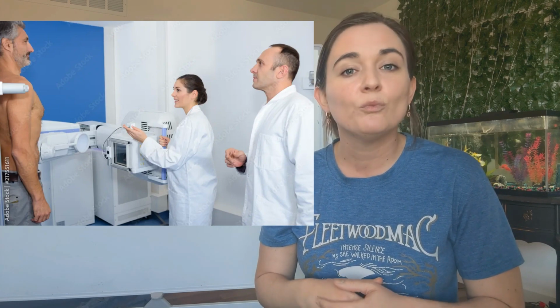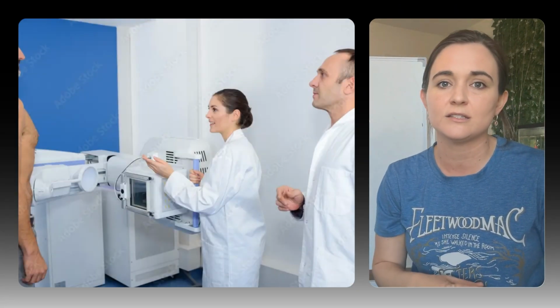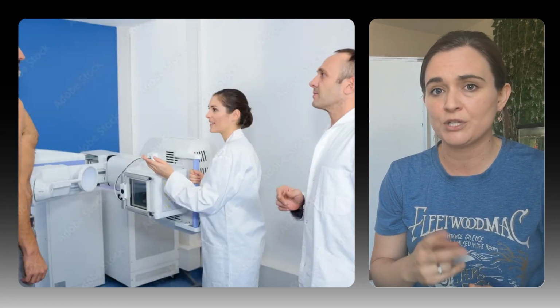If Mrs. Garcia can stand or sit upright safely, we want to take this view next. Why? Because air rises, and upright positioning is how we catch air fluid levels and free intraperitoneal air. We raise our central ray to about 2 inches above the iliac crest. Ensure both diaphragms are included.